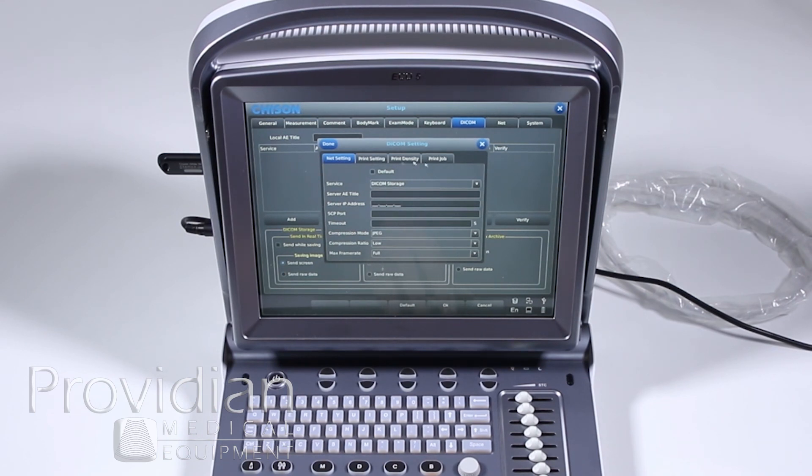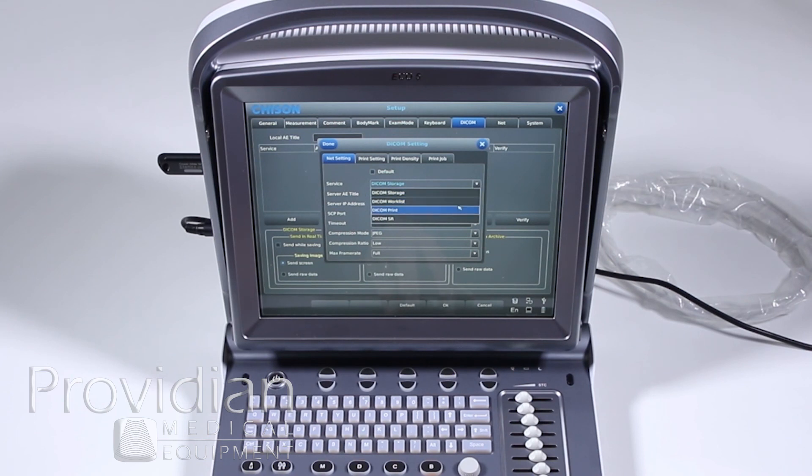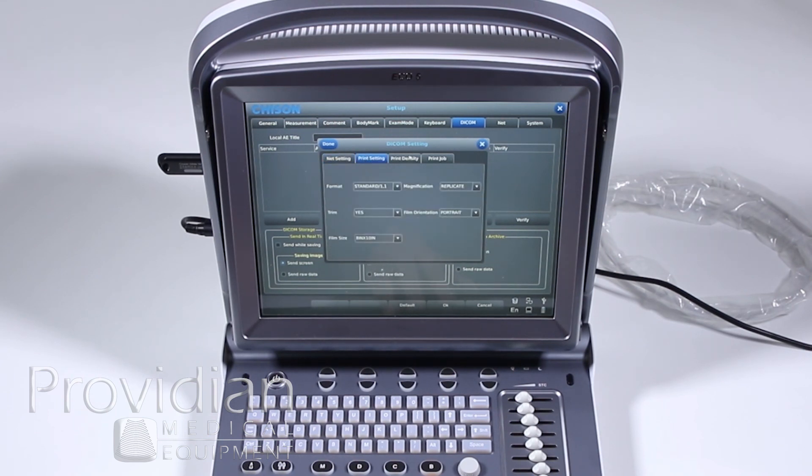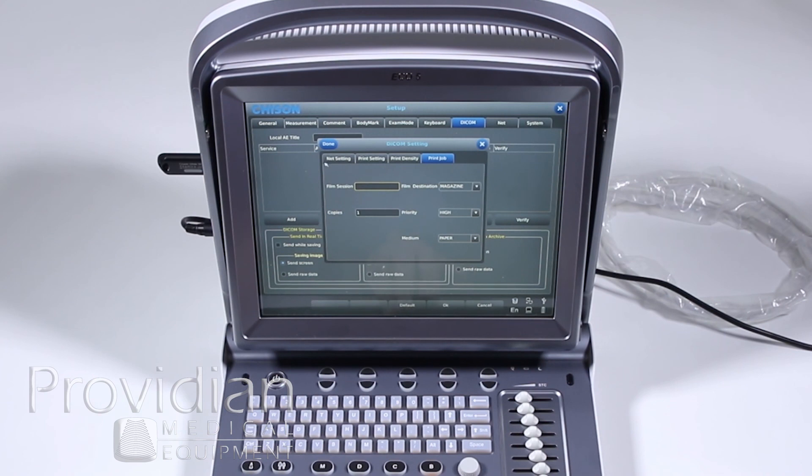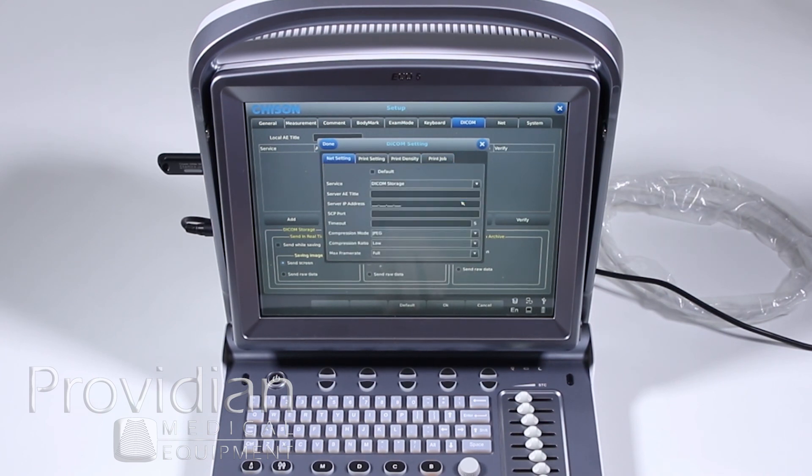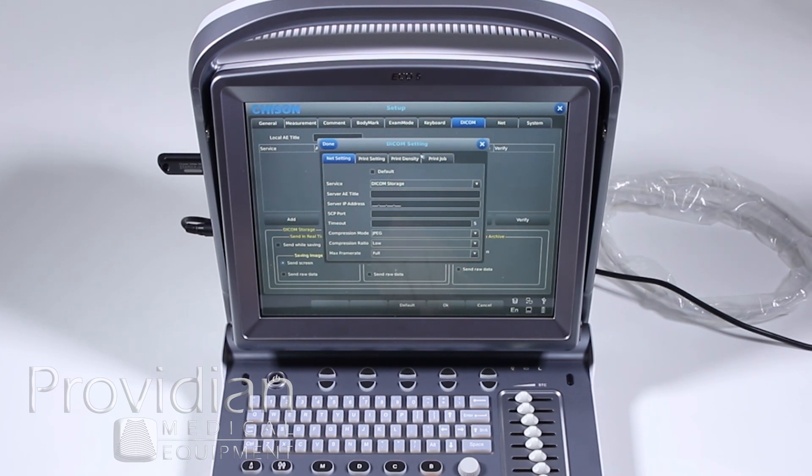Here's your settings for DICOM print, density and print job, depending on what it is that you're wanting to do, how you'd be able to adjust those. So originally we have the net. If I do DICOM storage, note that I can't do any of these print jobs or anything of that sort. So you'd want to set up each one of those services in that DICOM setting.